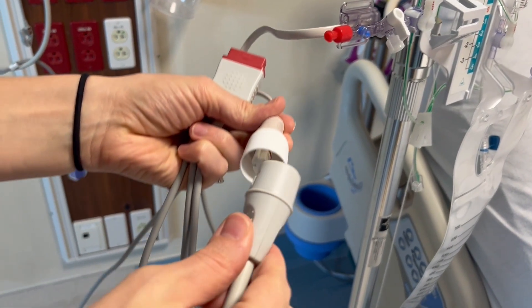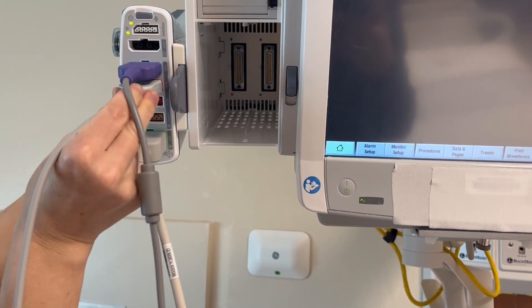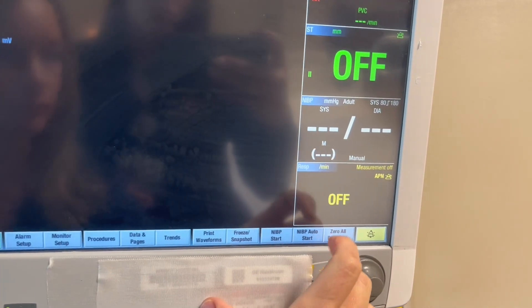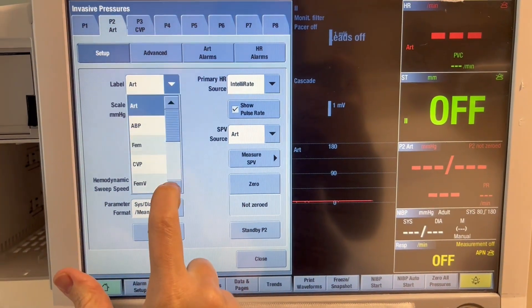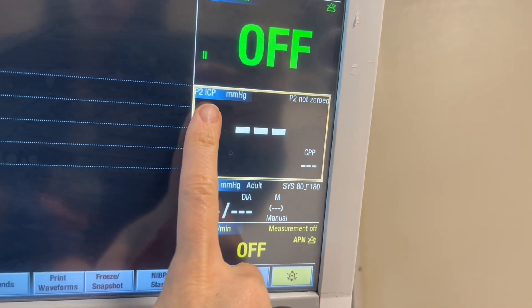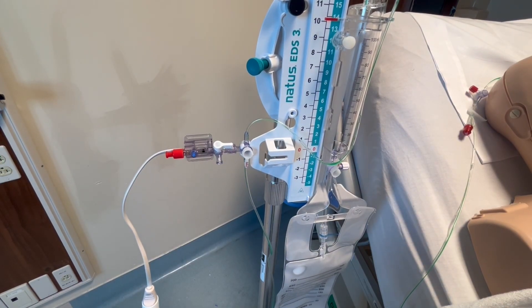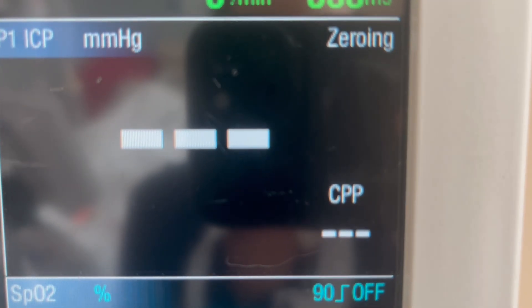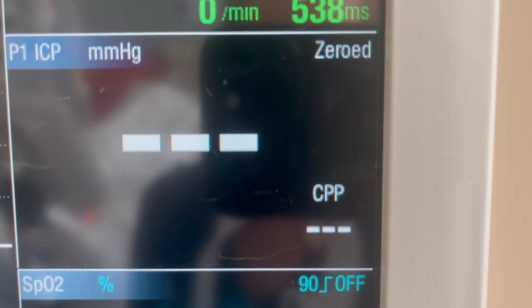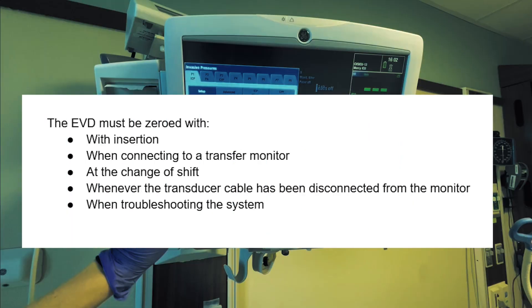Now it's time to connect the EVD to the bedside monitor. Take the pressure cable and connect it to the transducer, then plug the pressure cable into the bedside monitor and wait for the window to pop up. Select ICP. To zero the transducer, turn the transducer stopcock off to the system, open the transducer to air, press zero on the bedside monitor, and then place a new red cap on it. The transducer must be zeroed at insertion, when connecting to a transfer monitor, at change of shift, whenever the transducer cable has been disconnected from the monitor, or when troubleshooting the system.